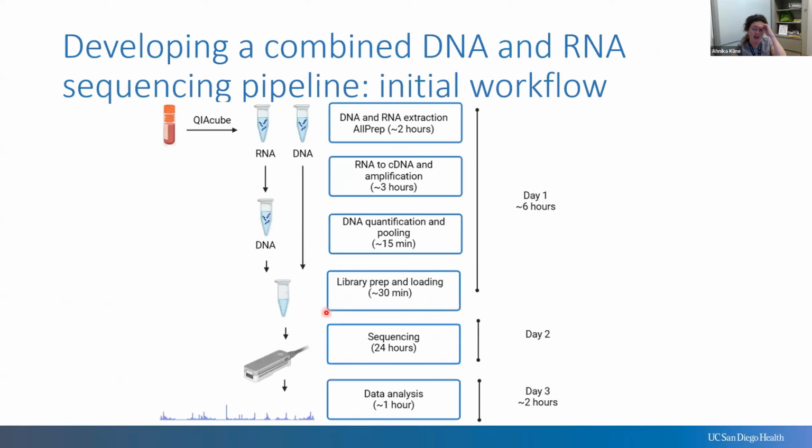So one of the things that affects our sequencing is that it needs to be a clinical workflow. And so initially, Anna, who did a lot of this work, the workflow was to purify the RNA and DNA, amplify the RNA to cDNA, quantify and pool all the DNA together, and then do a library prep, load and sequence for, say, 24 hours, and then do data analysis. But that workflow is a 3-day workflow. And remember, if this is eventually supposed to be a clinical test, it's important to think about a workflow that actually could have meaning over existing diagnostics, right? Where a culture takes only 2 days to grow, for example.